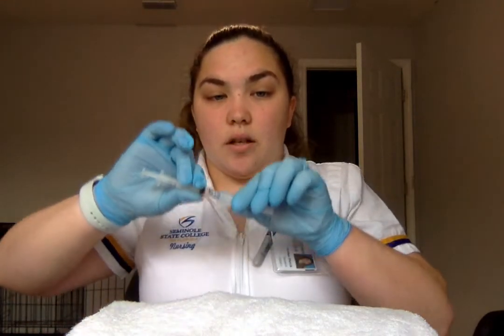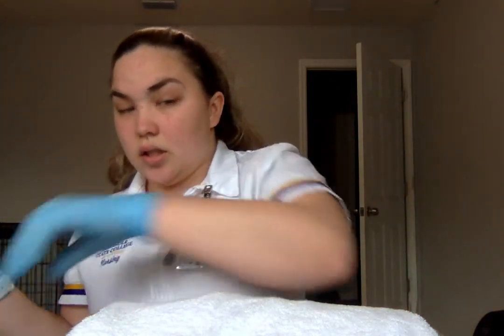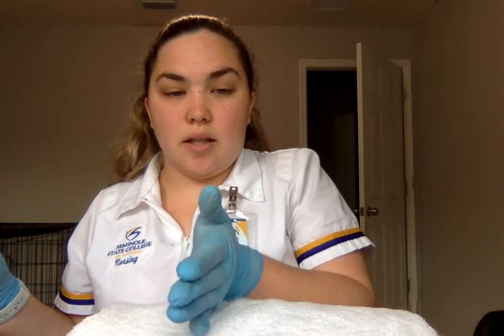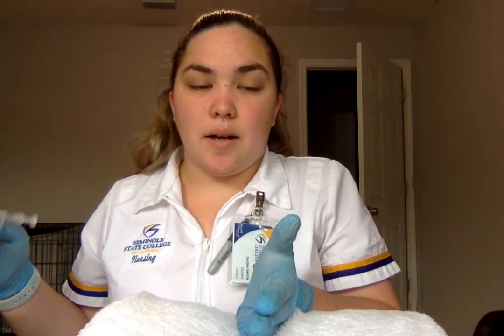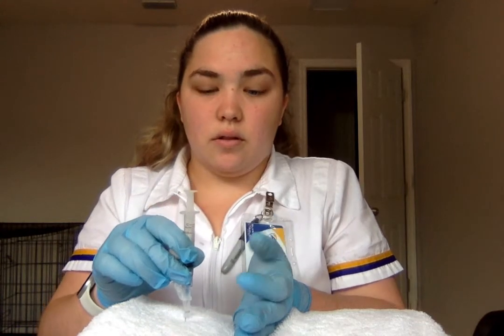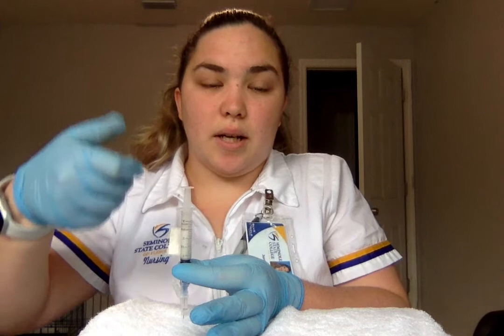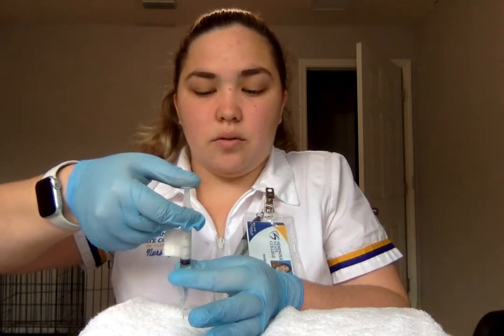And then once it's air dry, I'm going to uncap my needle. I'm going to set this to the side. I'm going to displace the skin, so that just means pull it over to the side, hold the muscle back. I'm going to insert at a 90-degree angle, like a dart, so nice and quick. And I'm going to hold it steady and slowly inject the medication because we want it to absorb into the muscle, so I'm going to go slow.